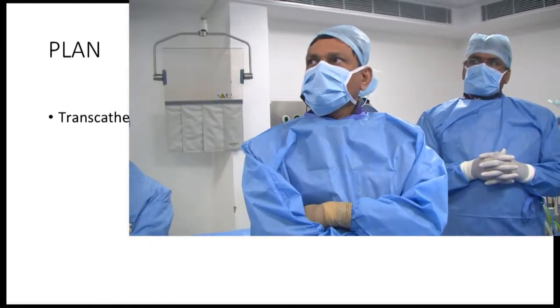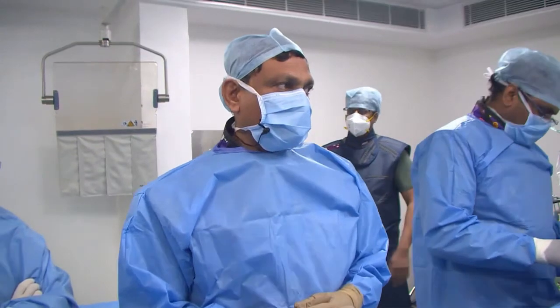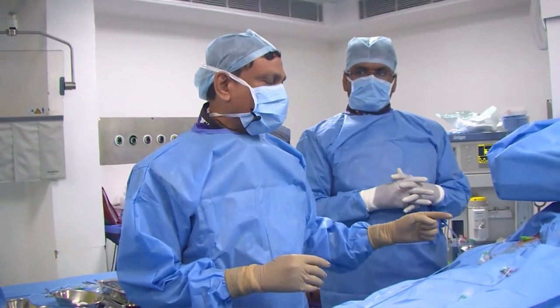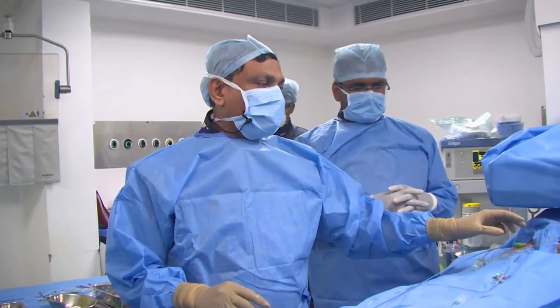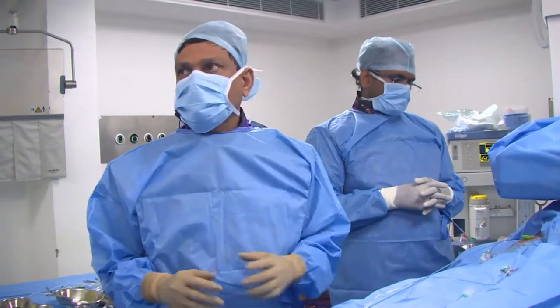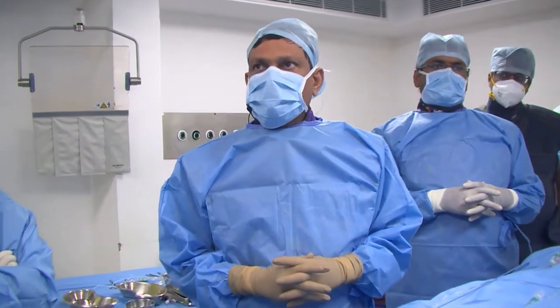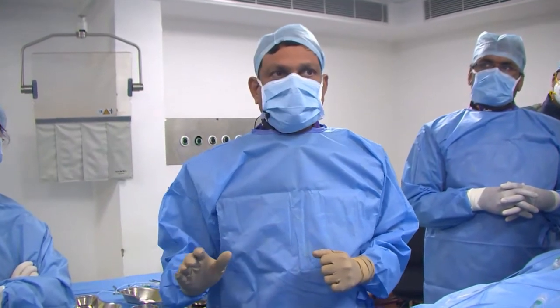Next to Nageshwar sir. Yeah, thank you very much, Bhargavi. We will show you the pictures of what we have done. Right now the child is anesthetized, general anesthesia, intubation. We have a 6 left femoral artery and 4 femoral artery, and right 6 and left 4 femoral, and jugular vein we have taken. Our plan is to go and close the fistula as distal as possible using a device. We will show the pictures and we will take the plan from you also.